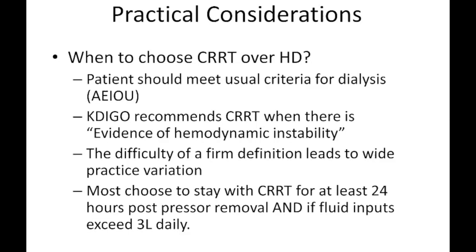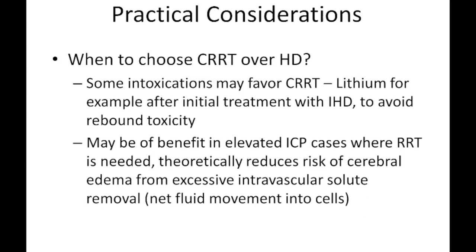When do we convert people back from CRRT to typical intermittent hemodialysis? Well, we generally like to see patients come off pressors for at least 24 hours. That's part one of a two-part assessment. And the second one is how much fluid are they getting in per day? Even though CRRT is a slower fluid removal per hour, the fact that it runs most of the day allows you to remove more fluid over time.